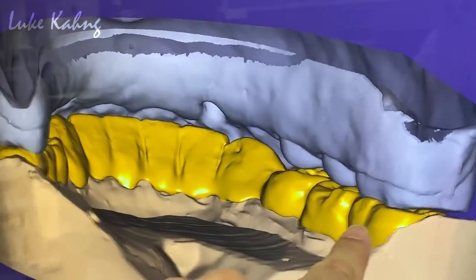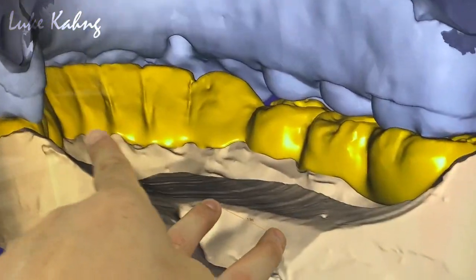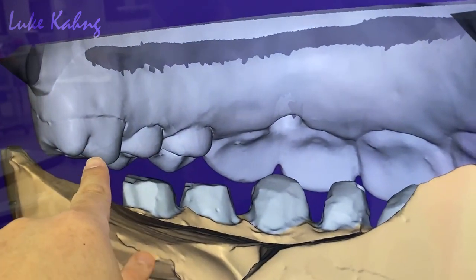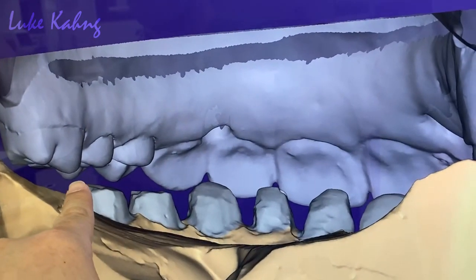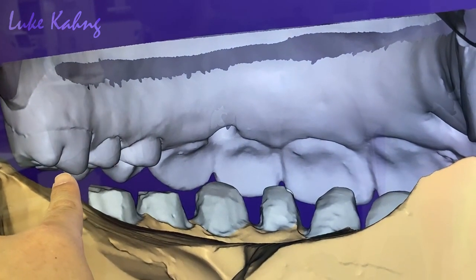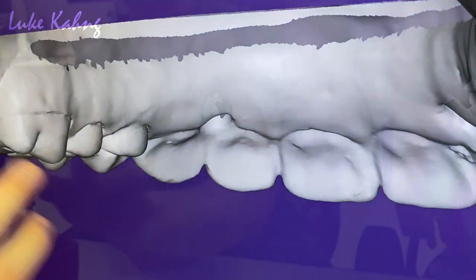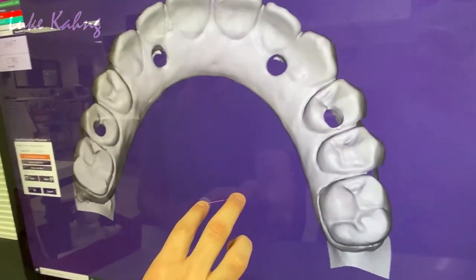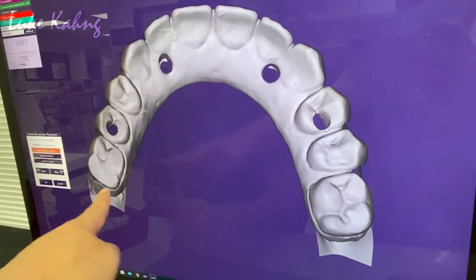We trim here and trim there — it's still tight, as you can see. I have to note for the doctors: the opposing tooth is zirconia. So now as we are printing the temporization, you can see the zirconia — he's grinding quite a bit here.